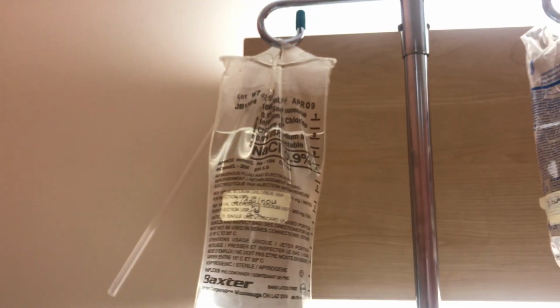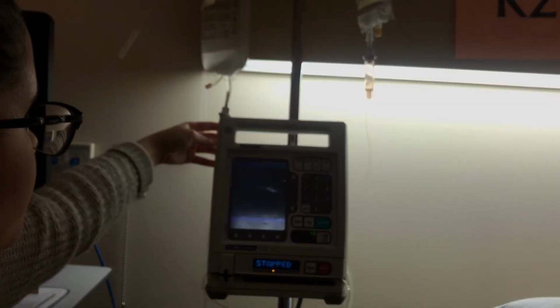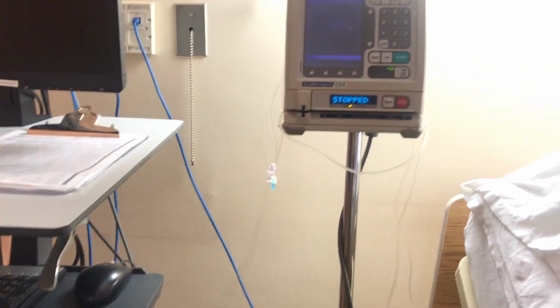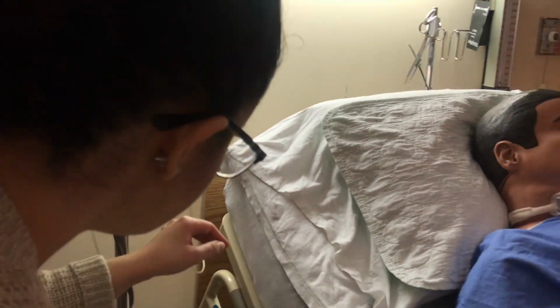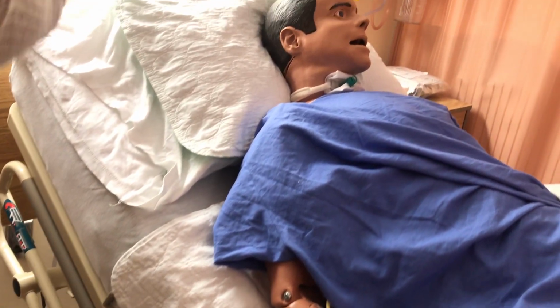Now because the rate is so low, she is going to be getting the carrier of normal saline here that the nurse already primed and connected. So I see that this is going via gravity right now. It's unclamped, we're good to go. And I see that the tubing here is portless, which we need for continuous infusion. So now that I've done my second med check, I can go ahead and connect this to my patient.